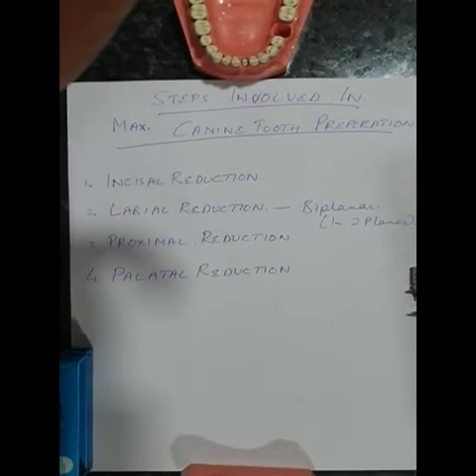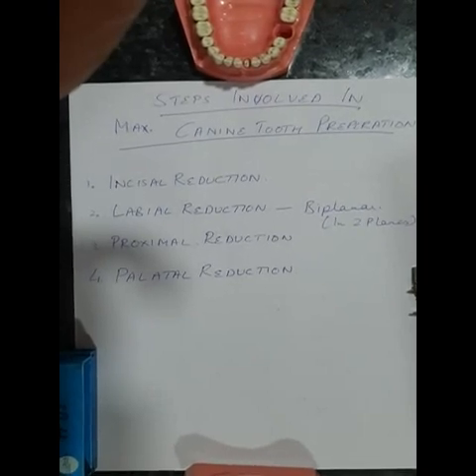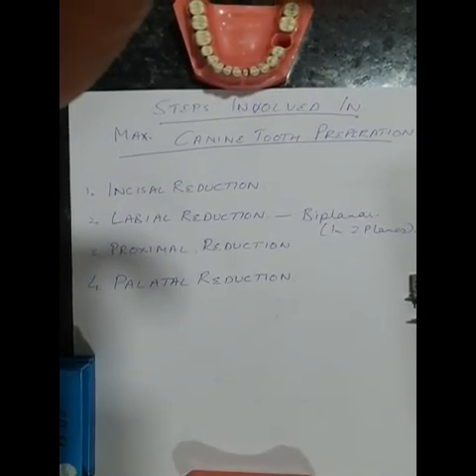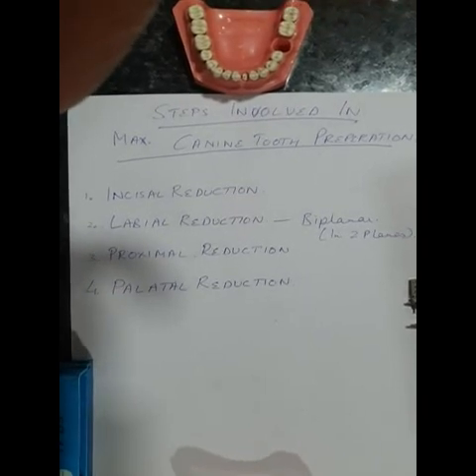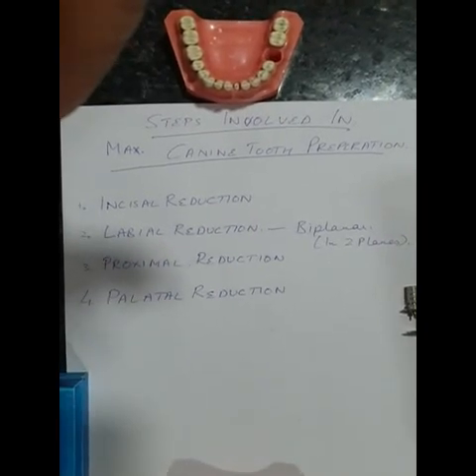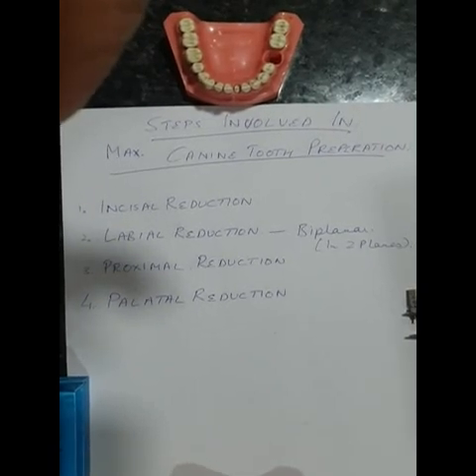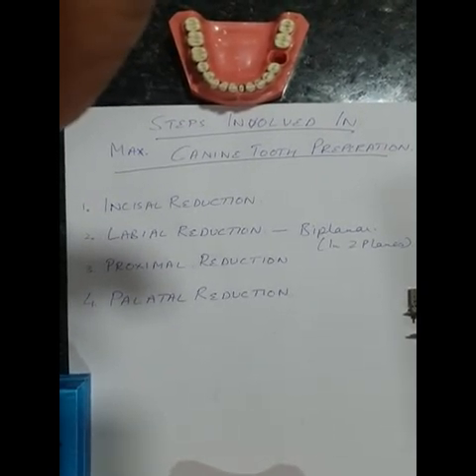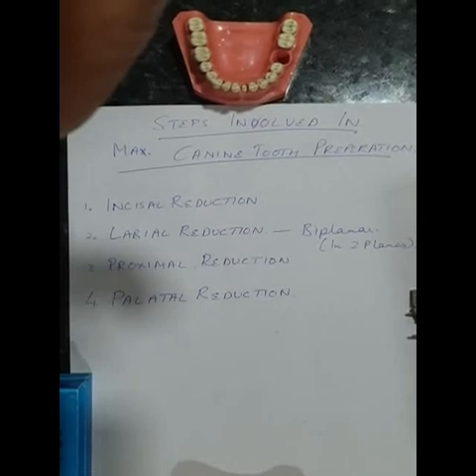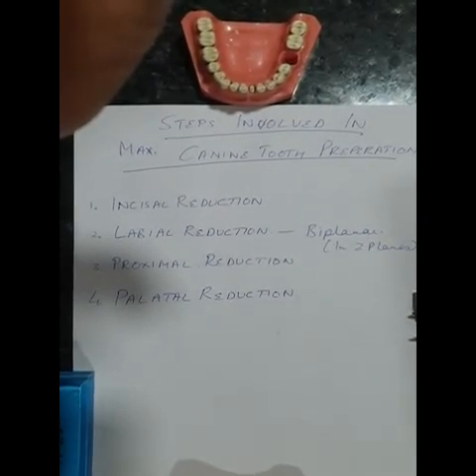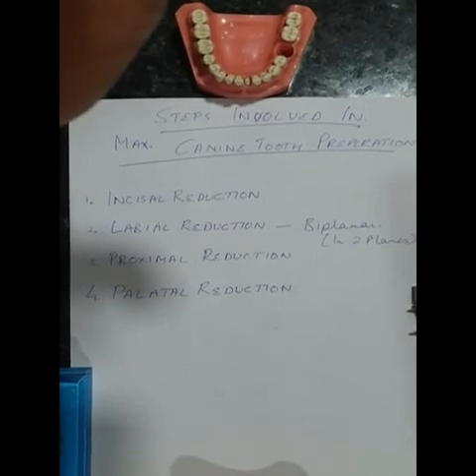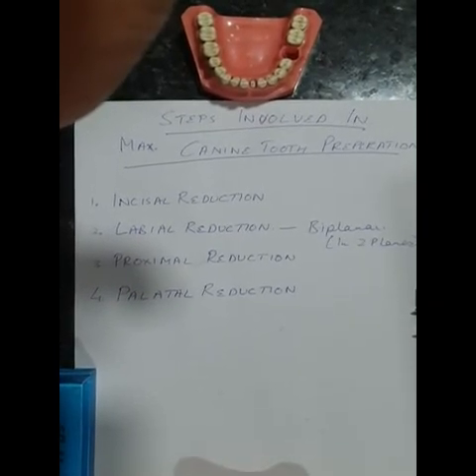With the help of a round end taper or torpedo bur, we first move the bur in the cingulum area. Once the cingulum area and the margins on the palatal side are complete, we focus on the lingual slope which lies above the cingulum of the canine. That area is then reduced with the help of a flame-shaped bur. The curvature of the flame-shaped bur is placed on the lingual slope and we ensure a reduction that can accommodate the crown material, but not so deep as to compromise the strength of the canine.